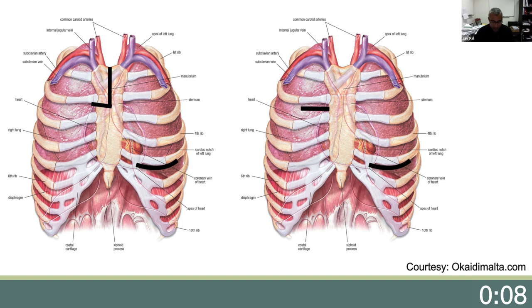This is a schematic of the typical incisions used for a thoracotomy LVAD implant procedure. The left anterior thoracotomy is pretty consistently in the inframammary crease. The outflow graft anastomosis can be performed through an upper hemisternotomy or a right anterior thoracotomy for a truly sternal sparing technique.